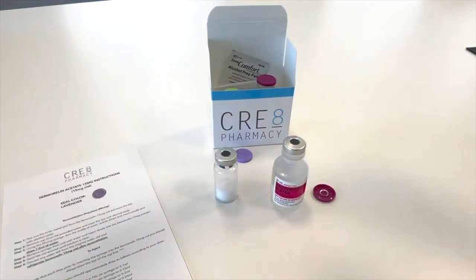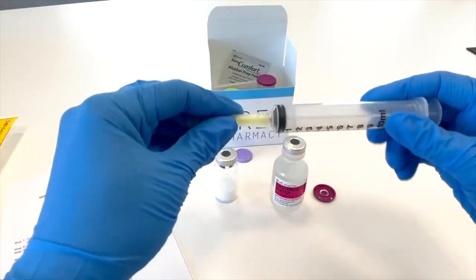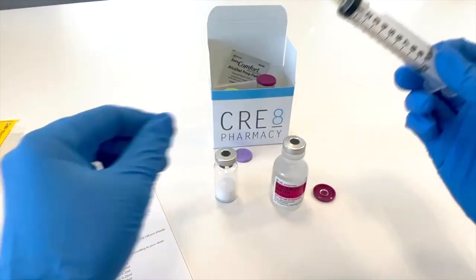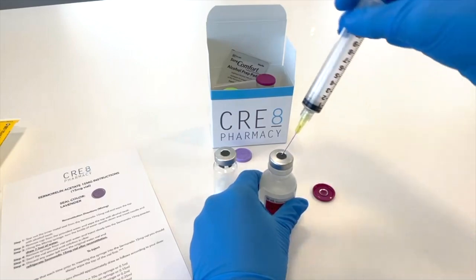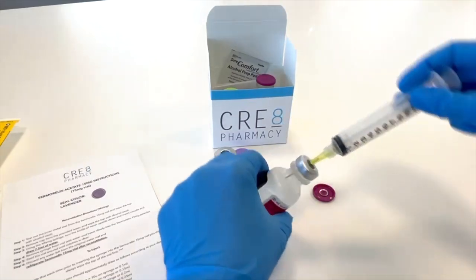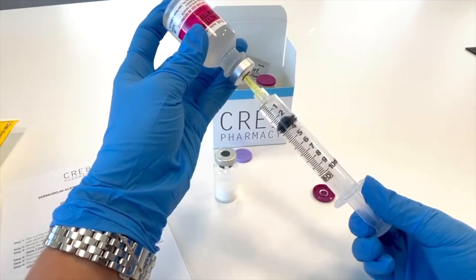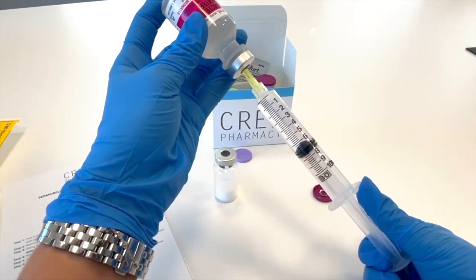The third step will be to carefully unwrap and uncap your mixing syringe. The fourth step will be to insert the syringe into the diluent and pull the amount of liquid needed for your medication. This will vary as to which medication you are receiving — please reference your mixing instructions.